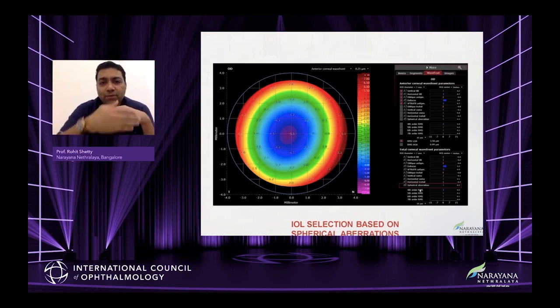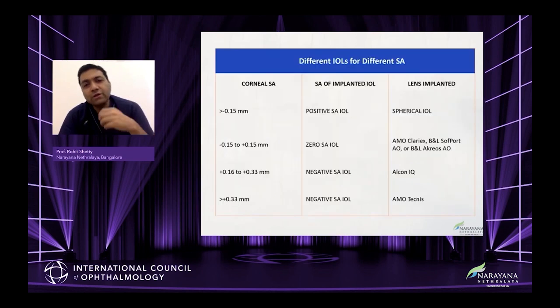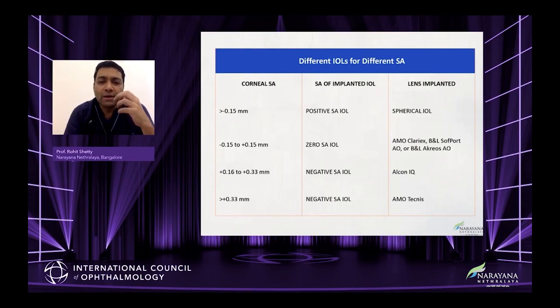So when you have a corneal plane which has a different aberration, the depth of focus lenses would behave differently. So knowing the spherical aberration is very important also in planning your multifocals, and also planning your extended depth of focus. So it's just not your simple biometries or topographies. You can play around with the optical tools. Basically it helps you to look at the multiple dimensions and multimodal aspects of what it does, and try to build your premium practice.